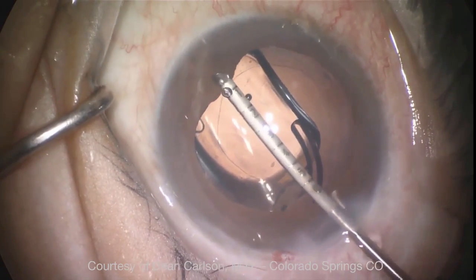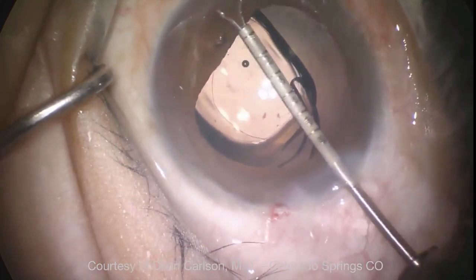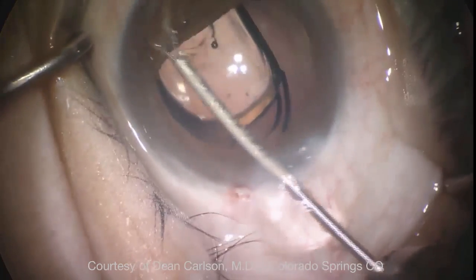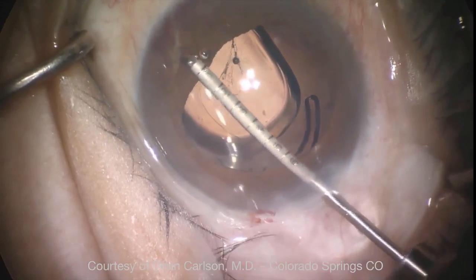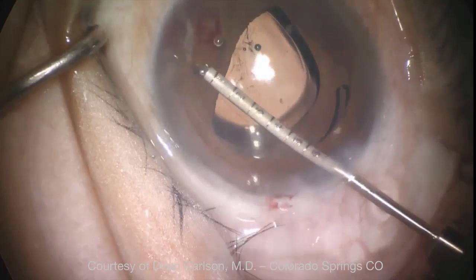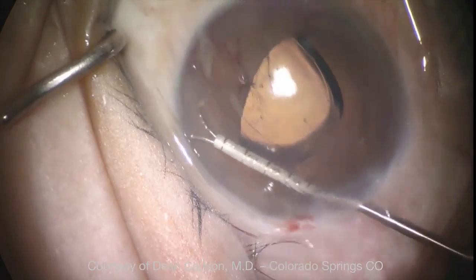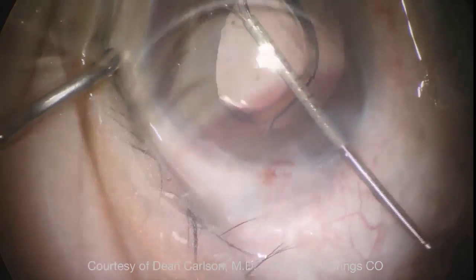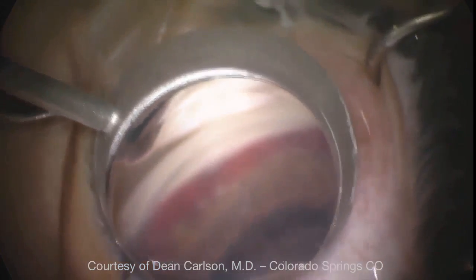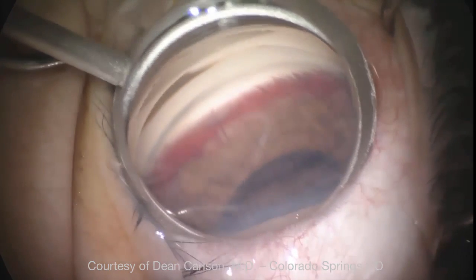This is a patient who has just undergone cataract extraction — you can see the lens is still not fully unfolded. Dr. Carlson is using micro forceps to grab the peripheral iris and pull it away from the angle, breaking the synechiae. This is done 360 degrees, and post-operatively there will be some hemorrhage, but the angle should be more open.